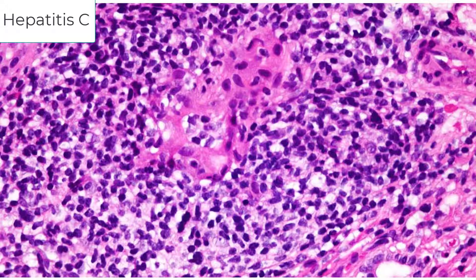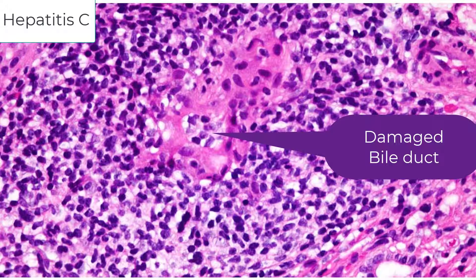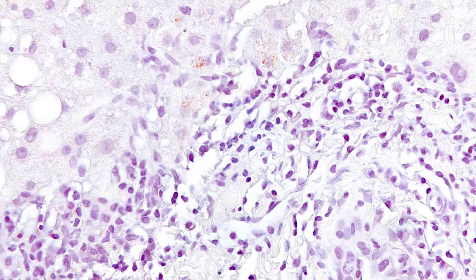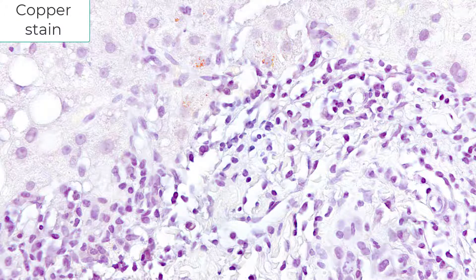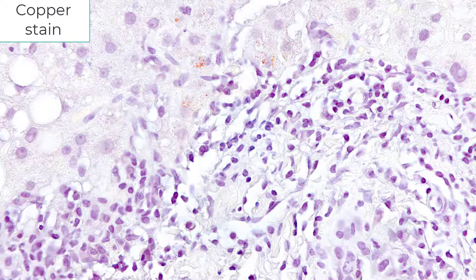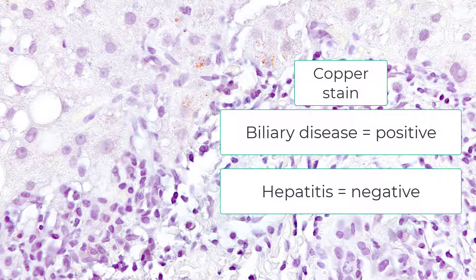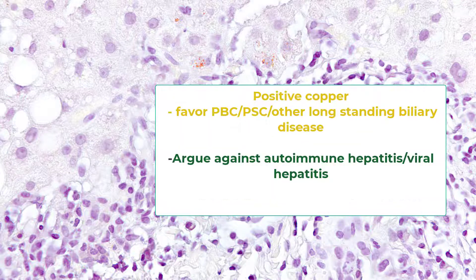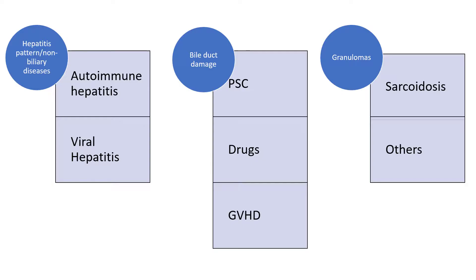This is hepatitis C infection — something we don't see very much of anymore — to demonstrate that other forms of hepatitis, such as viral hepatitis, can damage the bile duct. This is a copper stain from a patient with primary biliary cholangitis, and you can see periportal copper accumulation. The copper stain is incredibly helpful to distinguish disease primarily affecting the bile duct — where the copper stain tends to be positive — versus a hepatitis, inflammation of the hepatocytes, where the copper stain is negative. So if you see a positive copper stain, think biliary disorder.